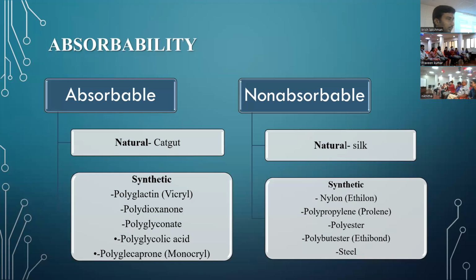Okay, and now coming to natural versus synthetic. What is the advantage of natural sutures versus synthetic sutures? So, natural means they have antigens, so they react. That is the disadvantage. Where do you get natural sutures from? Yeah, it's easy to get, manufacturing and all is much easier. So it is cheaper. That is the only answer. It's only cheaper.